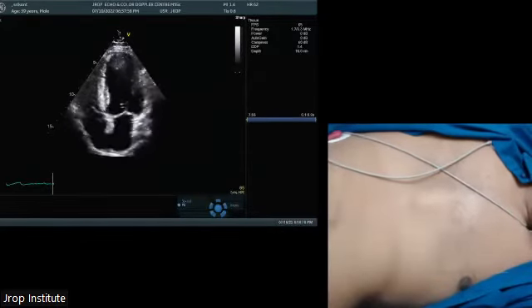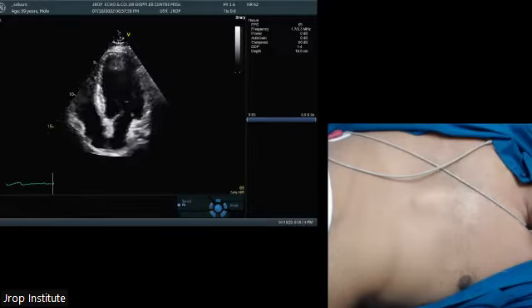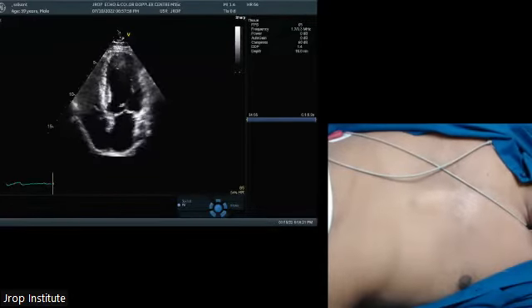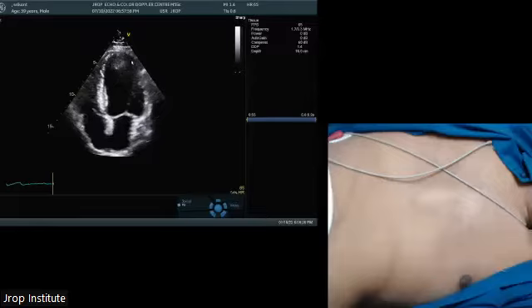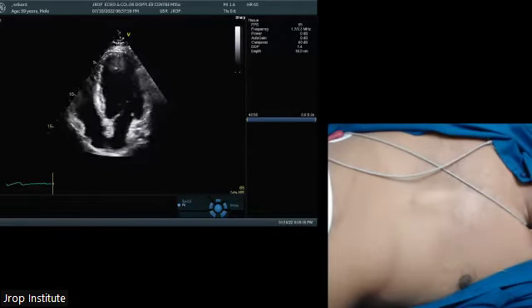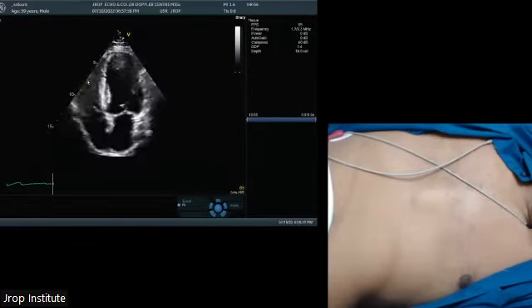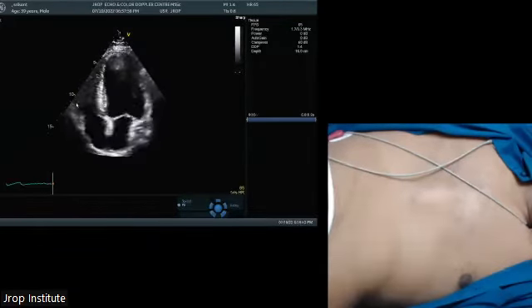And these have to be identified very thoroughly. Look, if I don't identify thoroughly, I'll not be able to tell you what kind of wall motion abnormalities I've got. As I said earlier also, mid and basal septum supplied by RCA. Apical septum supplied by LAD. Apical lateral wall supplied by LAD. And mid and basal lateral wall is supplied by circumflex. If there's a proximal RCA lesion which involves the RCA territory, even the RV free wall would be hypokinetic. Right?